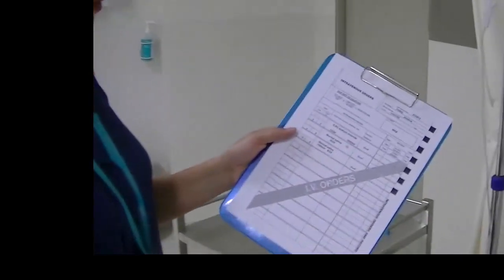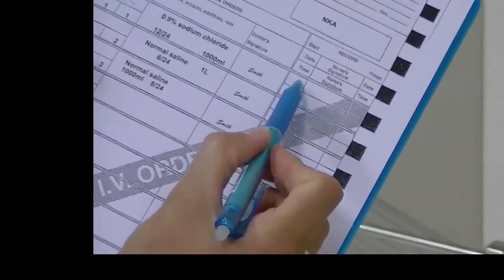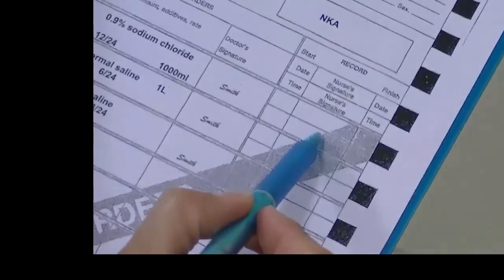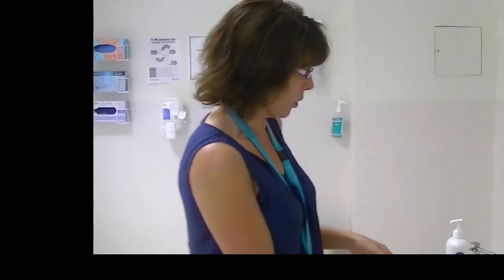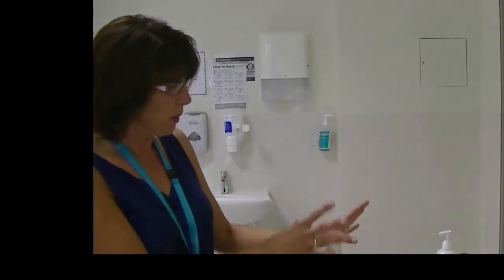When I go to do my paperwork, I need to sign the date, which is the 15th of the 12th, the time, which is 2 o'clock, I sign, and the nurse who checked the IV flask with me will also sign, and I also have to document it in the progress notes. If there was any adverse reactions or inadvertent things happened, I put it in the progress notes, but otherwise we're okay. And I need to clean up all my rubbish. There is no sharps, but I'll put all my rubbish away.